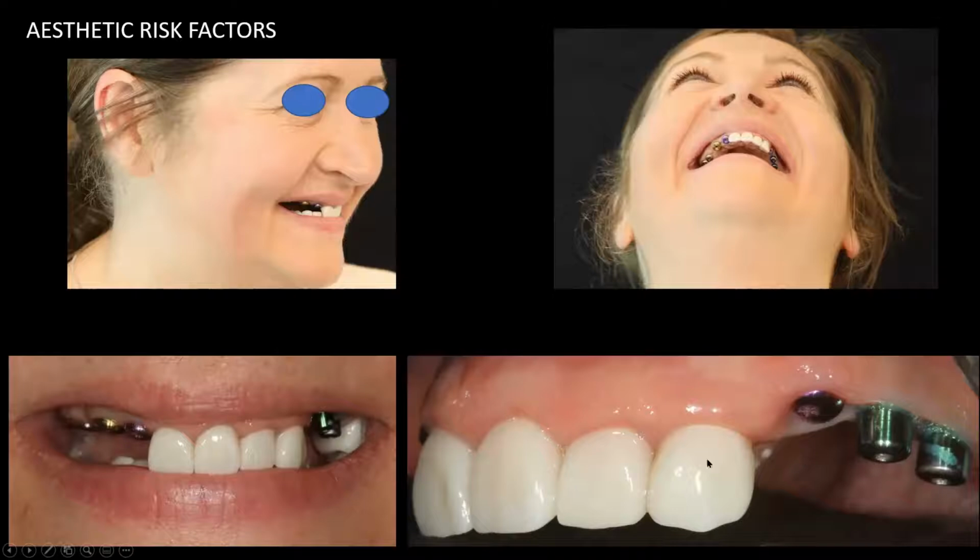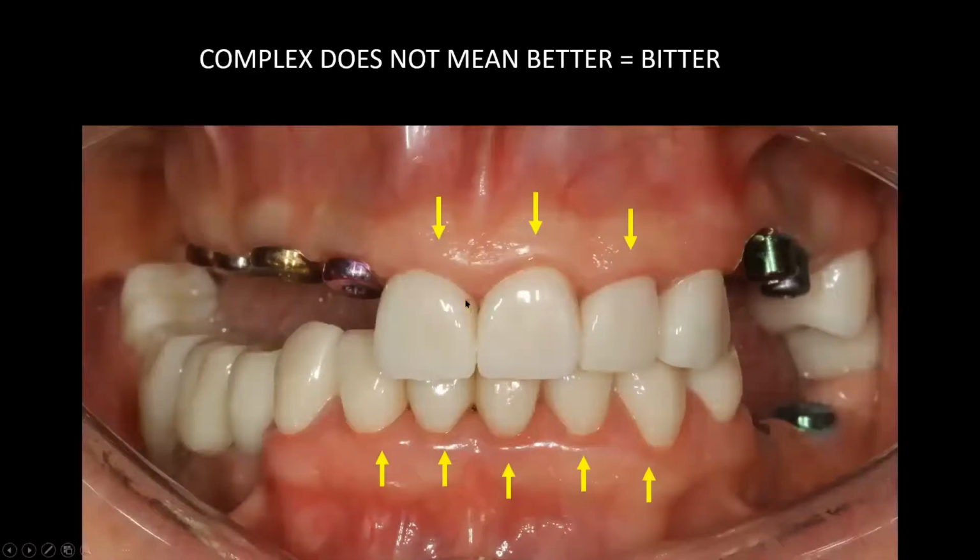If I was given a chance, I had to explain to the patient, from my point of view, I have to replace the full mouth before I go ahead and make a full temporary, change the occlusal prescription, and do a lot of other things, and then make temporaries, and then reassess for about 3 to 6 months, and then we go back and restore it. And I think she paid a lot of money to get to this stage, and naturally the cost of replacing this would be very, very expensive.